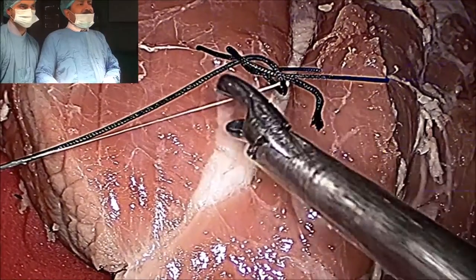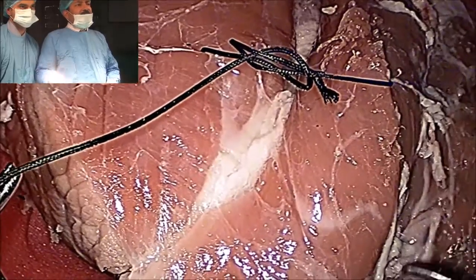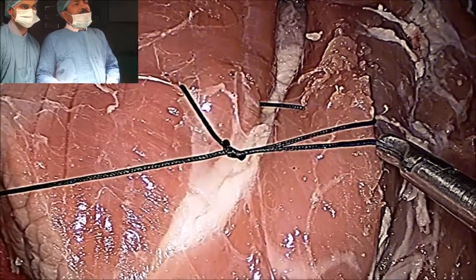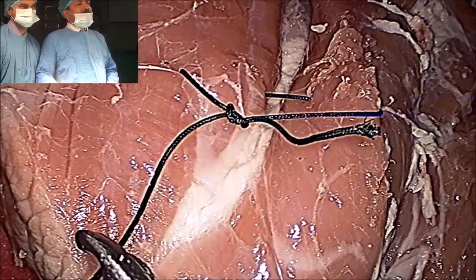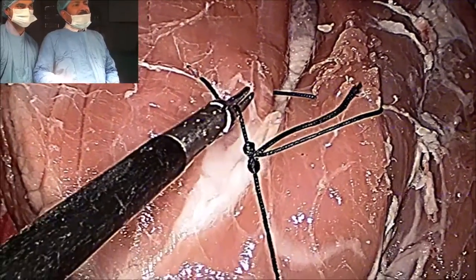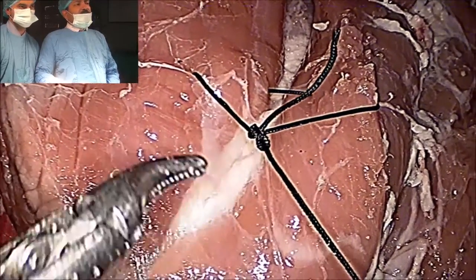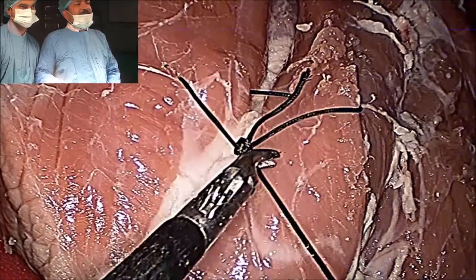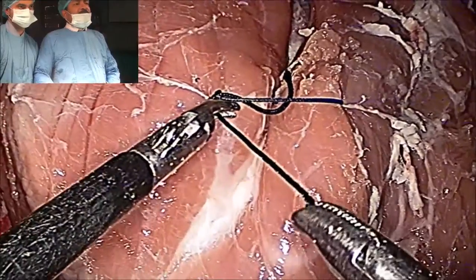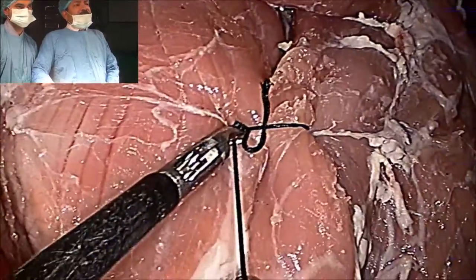Once the knot is there, you will make it moderately tight, and then pull this needle end — this is called tumbling. After tumbling, the knot is ready to slide. You will hold it by the Maryland and you will slide it. It is sliding. Again you go nearer, again you slide. Again you go nearer, again you slide. And it is completely tight.